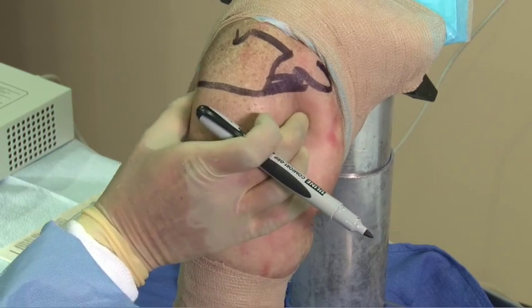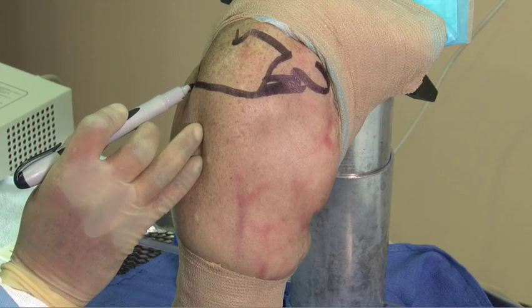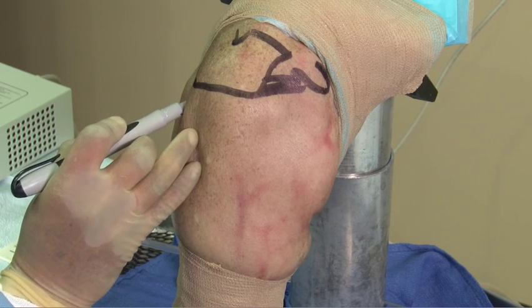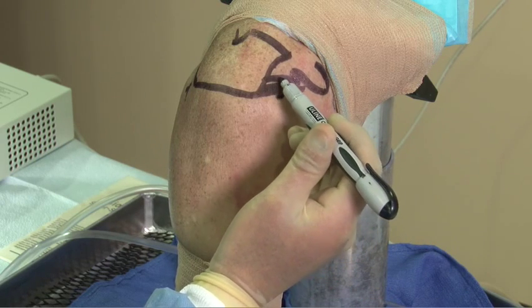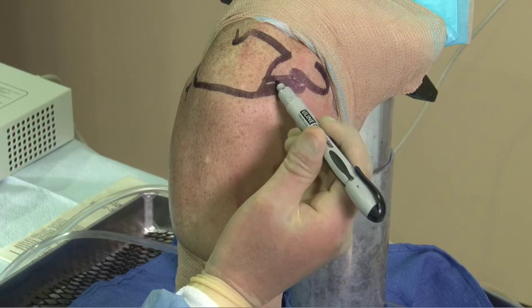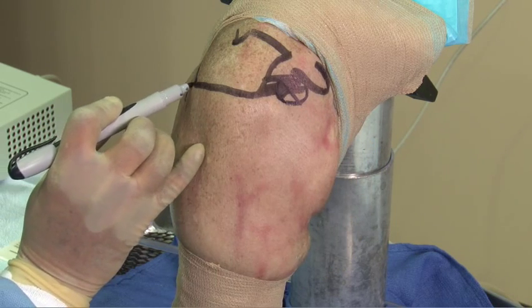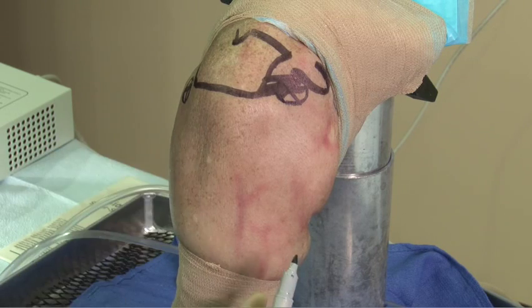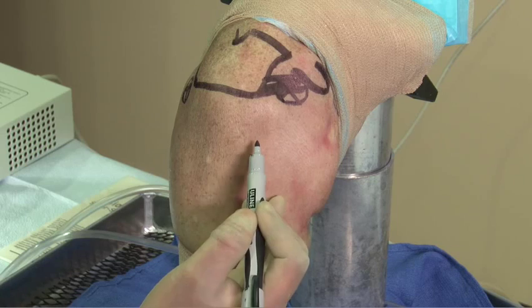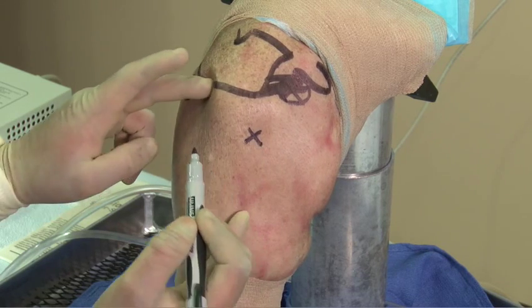We palpate the glenohumeral joint and place a standard posterior viewing portal. The anterior portal generally is placed halfway between the coracoid and the acromion. For rotator cuff surgery, we prefer to utilize anterolateral and posterolateral portals.